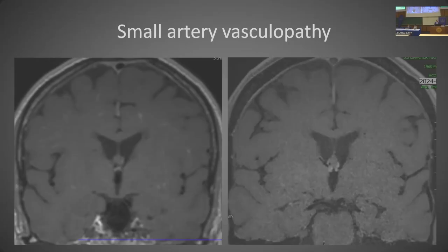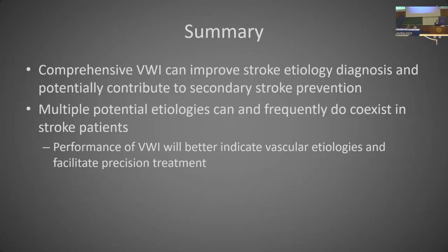We're thinking it's probably a small artery inflammatory vasculopathy because that's how they behave. Once they get steroids, all that enhancement melts away. And certainly the vessel wall imaging was helpful in terms of depicting that and changing patient management.